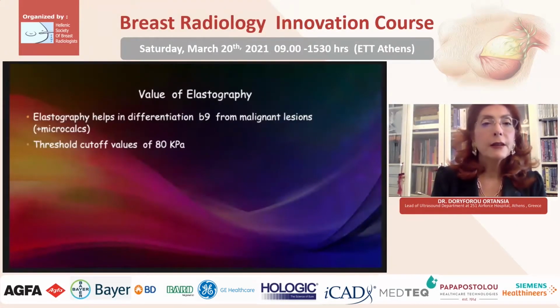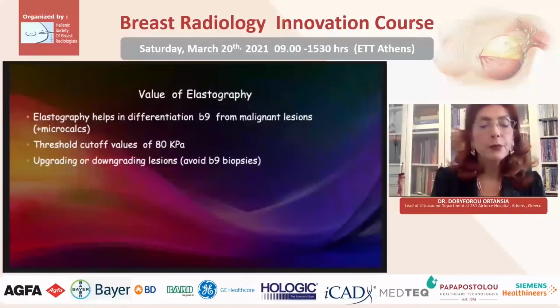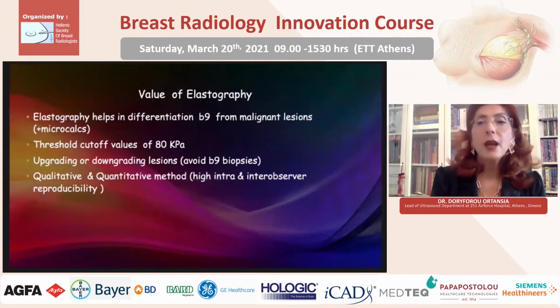Provided the cutoff value of 80 kilopascal, which is very useful. By this, we can upgrade or downgrade lesions and avoid benign biopsies. It gives a qualitative and quantitative method with high intra and inter-observer reproducibility.